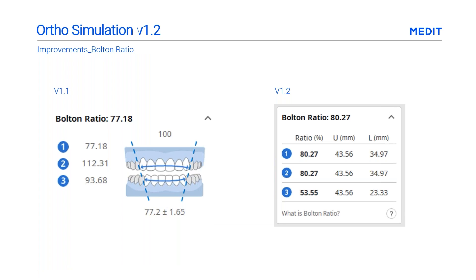Medit has also added length information to the Bolton ratio for a more precise understanding of tooth size discrepancy. In the previous version, only the ratios were shown.